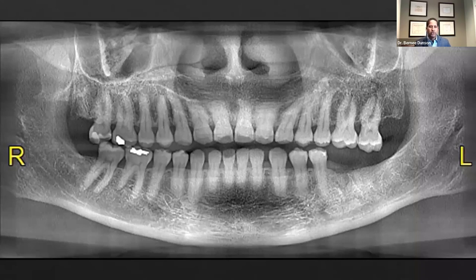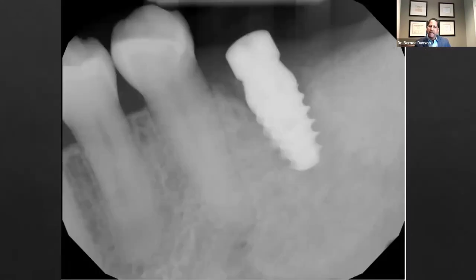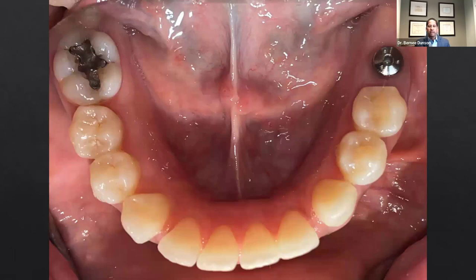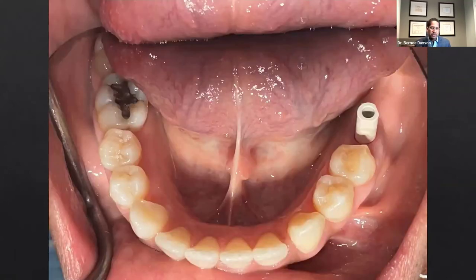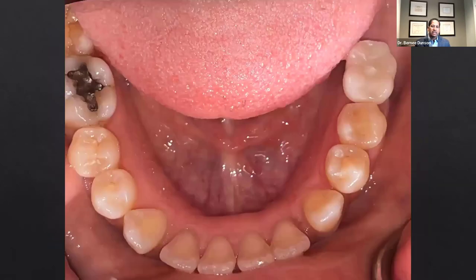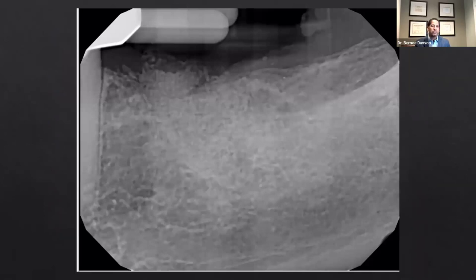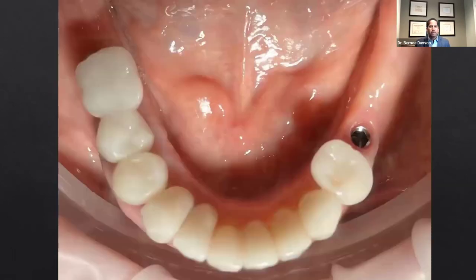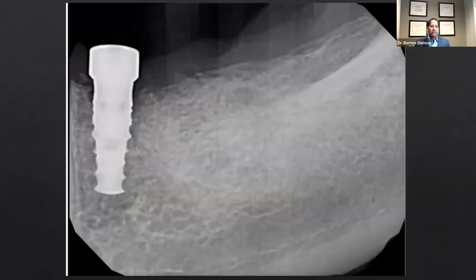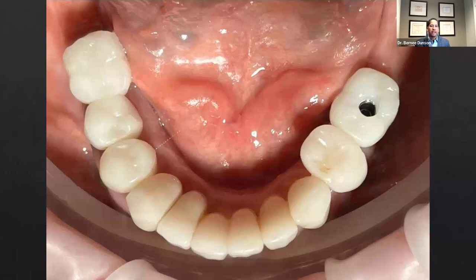Another case — a simple surgical component. An implant with a different design has features we like, and with adequate width and height we place our implant. In this case, we use modern technology: a scan body, digital impression, and a screw-retained solution. Another case: I did a ridge preservation where we lost a tooth, placed the implant, allowed three months of healing, and created a solution for the replacement of tooth number 19.